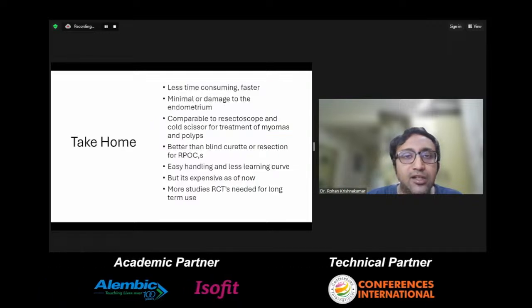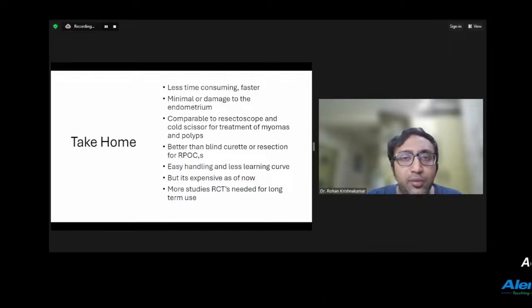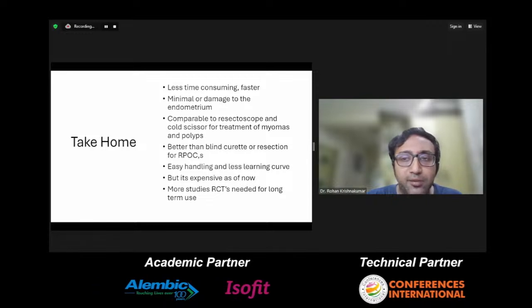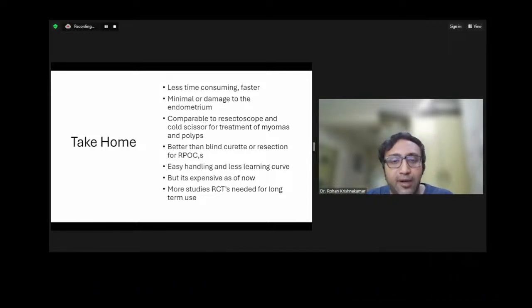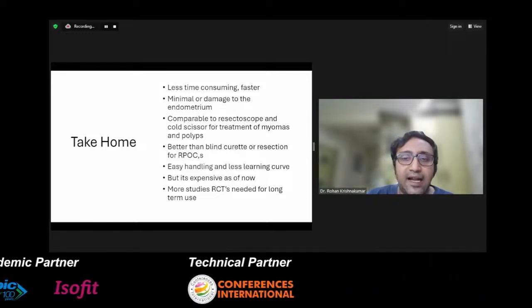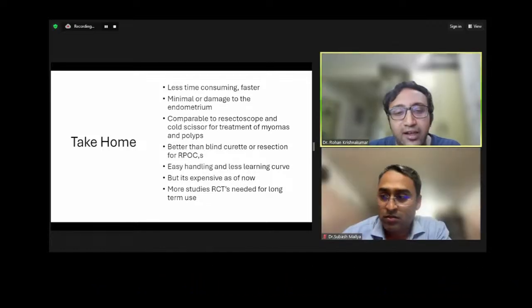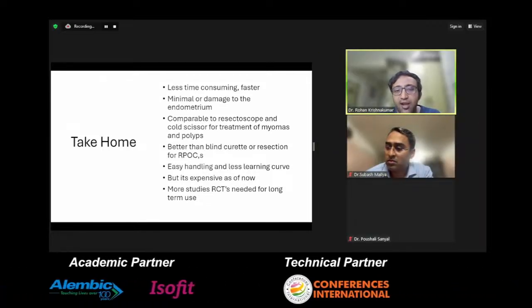To take home, it's less time consuming, minimal damage, comparable to resectoscope and cold scissors in treatments of myomas and polyps. Better than blind curettage for RPOCs, easy handling, less learning curve. Yeah, of course, it's expensive now, but only when you invest in technology do you do better.